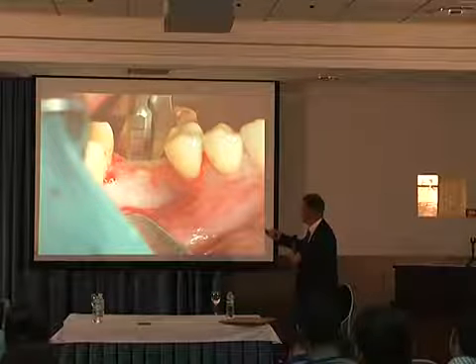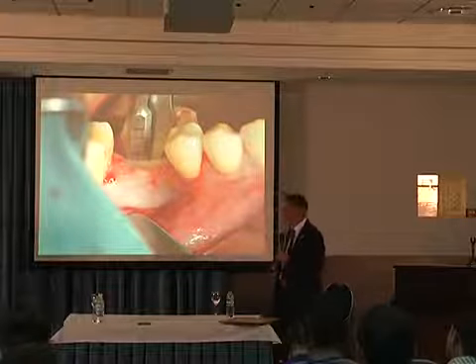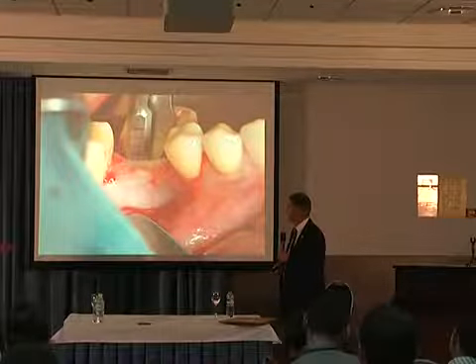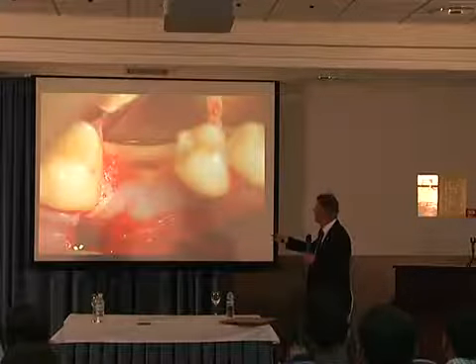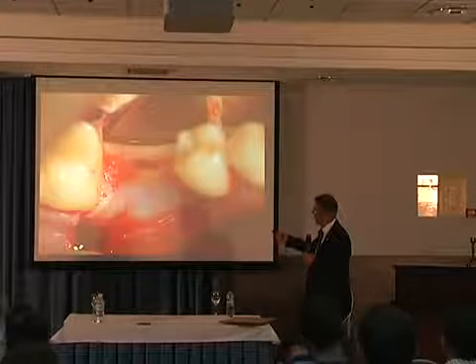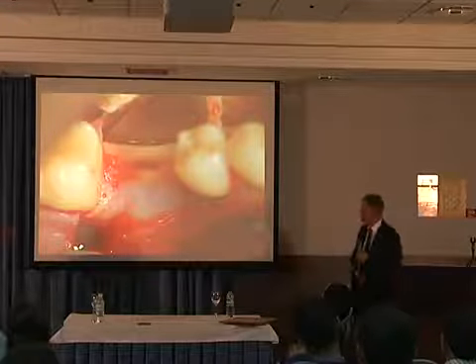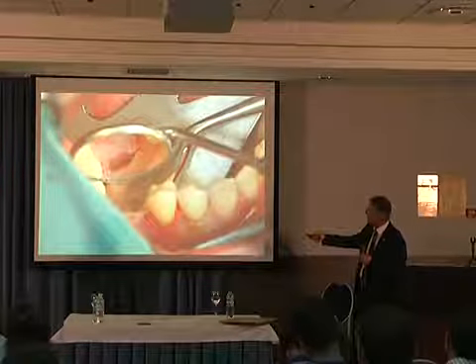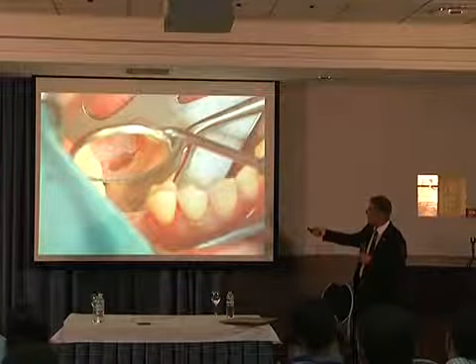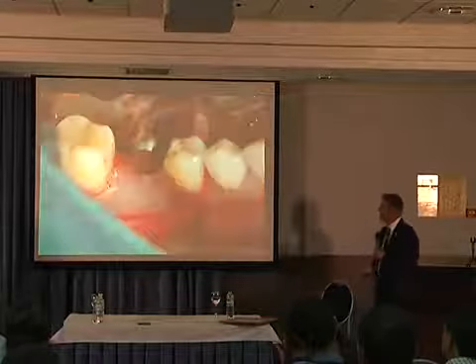And you see what you can get. И вы, наконец, видите, что вы можете получить. Вы получаете расщепление альвеолярного отростка. This is the new buccal plate here. Это новое как бы положение кортикальной пластинки и задняя стенка, лингвальная. In the mirror you can see quite nicely here the augmented or splitted area. В зеркале вы видите, насколько удалось расщепить альвеолярный отросток.